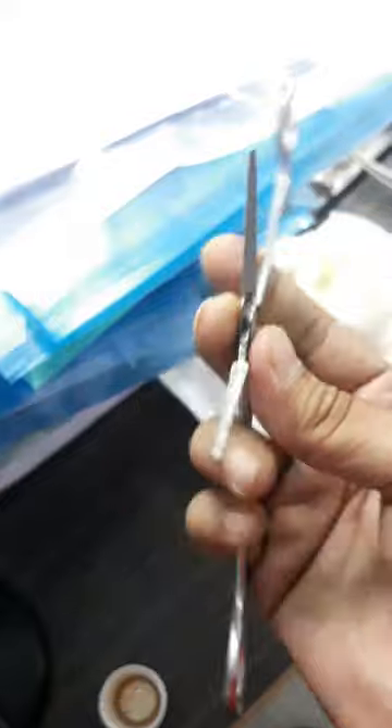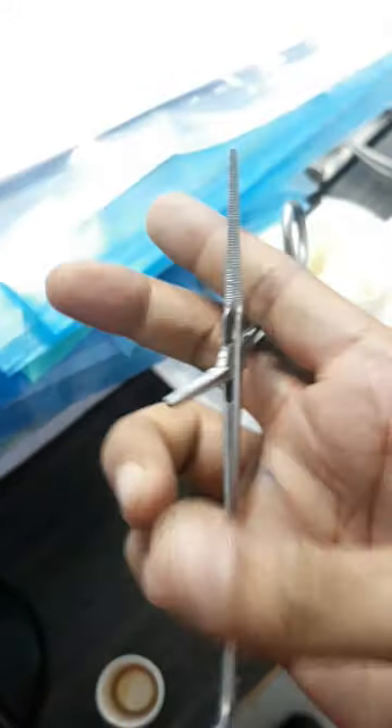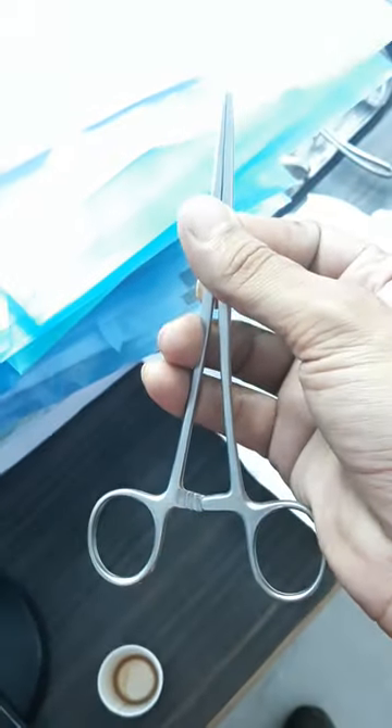The full length of the blades are provided with transverse serrations. The tip is conical and non-toothed. When the ratchet is closed, the blades are opposed. So this is basically a medium straight Haemostatic Forceps.